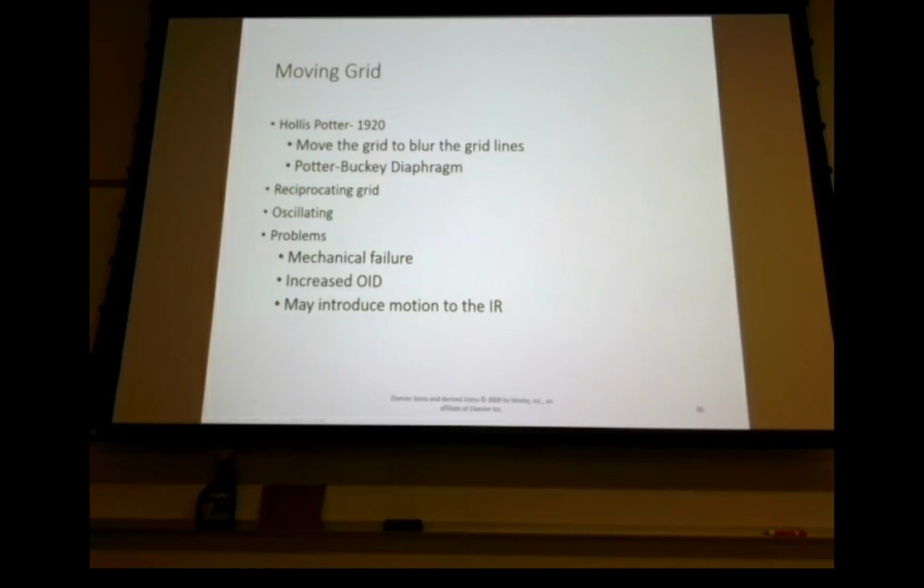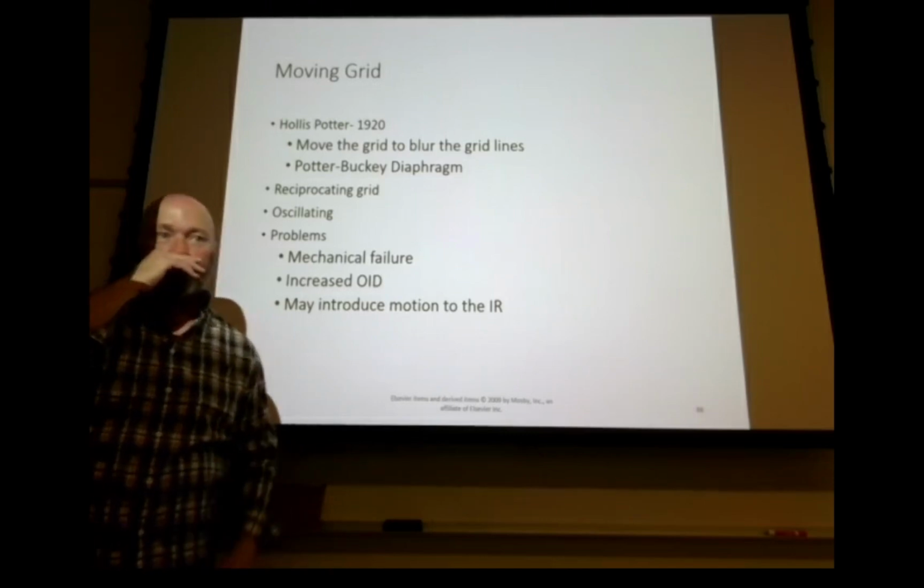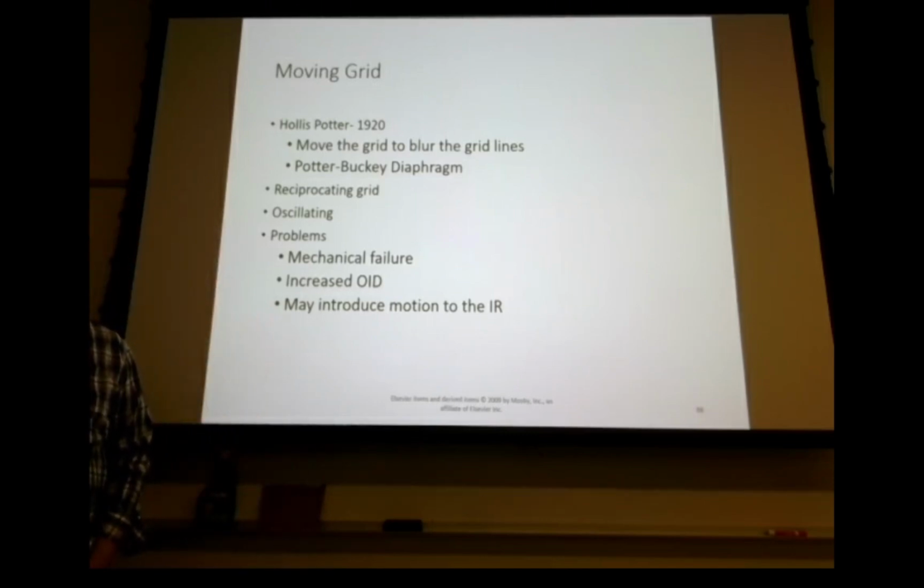All right, so any questions on grid types? Are they all either focused or non-focused? Fundamentally, yeah. A parallel grid is non-focused, and a crosshatch that's not focused is just two parallel grids together. So can you have a parallel focused or a parallel non-focused? No, the focus is always specific. Ask your question again, because I want to make sure I'm not running down a rabbit trail. Crosshatch can either be focused or non-focused. Parallel is just parallel. Okay. Right.